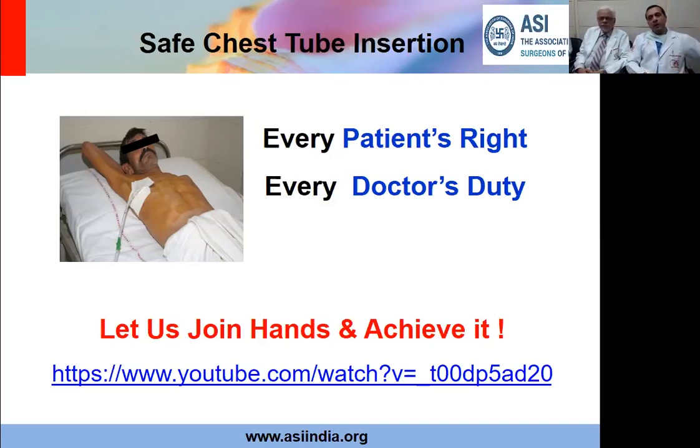But if you have egress completely, ask the patient to cough. Physiotherapy is vital. When the patient takes a deep breath and is able to breathe nicely, the lung expands and pushes the air and fluid out of the cavity. For me, the single most important factor that I want to see in the chest x-ray after insertion is lung expansion. If the lung is expanded, friends, all air leaks will stop. If you get complete lung expansion and there are some minor air leaks, those are usually from the parenchyma, periphery. 100% of peripheral air leaks will stop if the lung is expanded, because the lung goes and sticks to the chest wall and it forms a buttress there and it stops there.